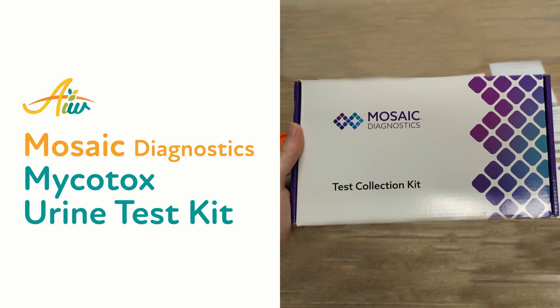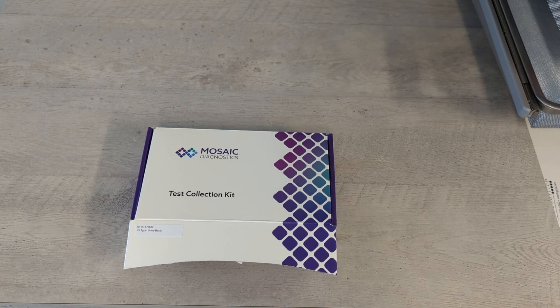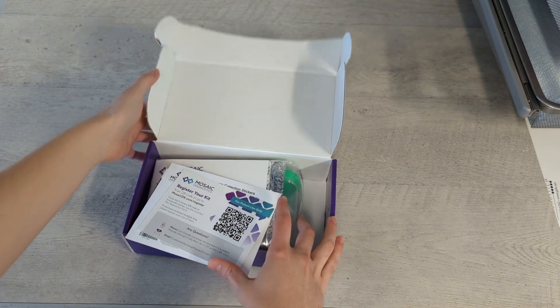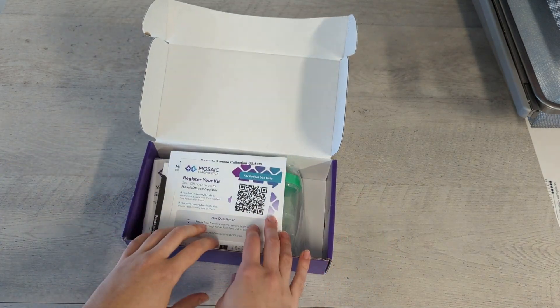This is the Test Collections Instructions video for the Mosaic Diagnostics Mycotoxin Urine Test Kit. You will have either gotten this in the office at AIW or had it shipped to you. It is prepaid through our office, so you will have paid for that before you got your test kit, and no payment is due to Mosaic Diagnostics. I'm going to go ahead and unpack this in the video so you can see exactly how this is presented to you as a patient if you've gotten this shipped to you.